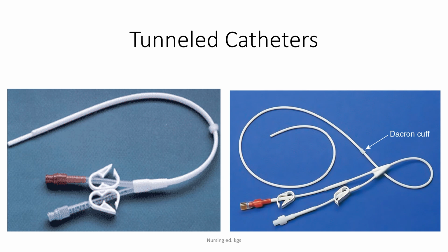Now, it's not represented here, but some of these newer cuffed tunneled catheters will have an additional lumen that's called a pigtail, where, as maybe the floor nurse, you'll be able to use that lumen to specifically get your blood work from. Normally, these hemodialysis catheters are accessed by the hemodialysis team, or if you're in the ICU, you're also able to use these. But normally, if you're on the floor, you won't be accessing them.